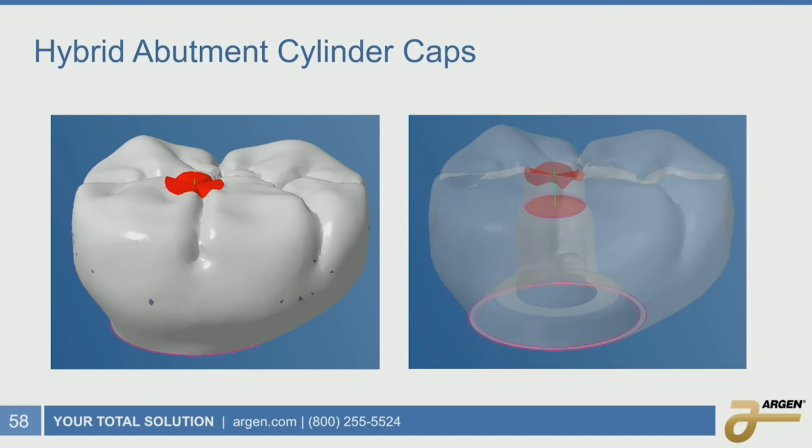So if we were to look here, and this is just on a transparency crown, we can see that it's marking the very top and very bottom of the upper screw channel. It's not going all the way down to the bottom because this is a different surface. When the CAM software is inspecting it, it treats the upward-facing surface and the downward-facing surface as two different parts of the object, and that's important to understand.